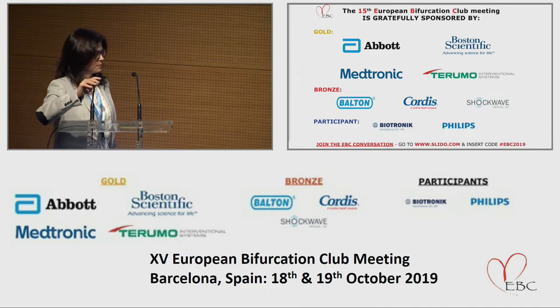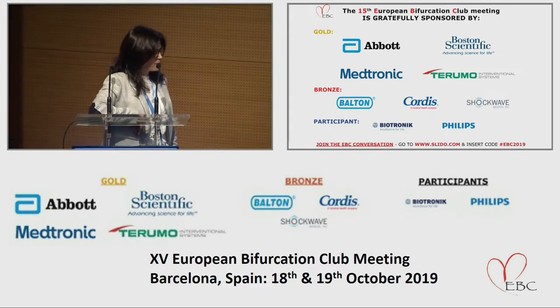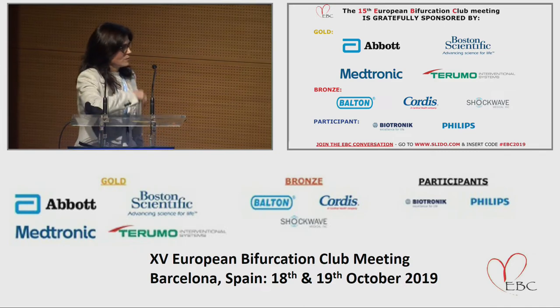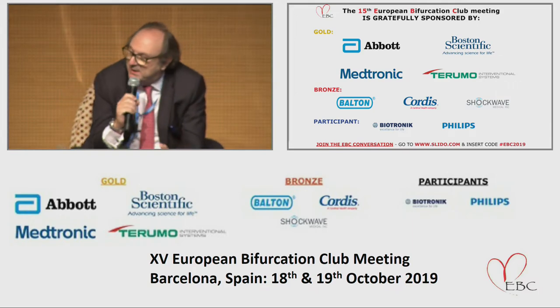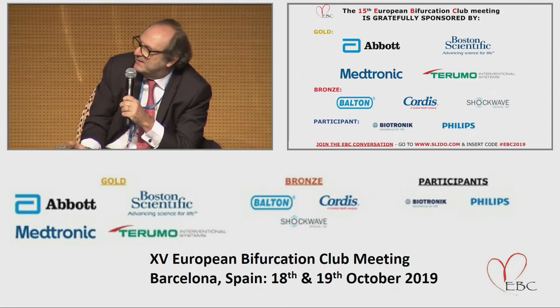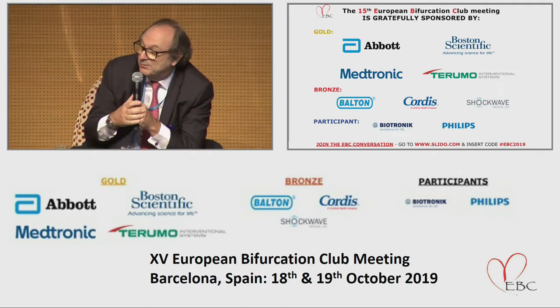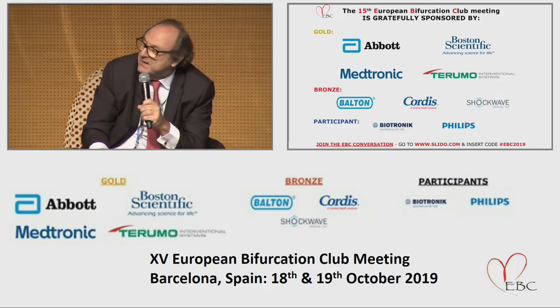Thank you, Nieves. You always show very beautiful images of calcified plaque by OCT. I'm impressed. But in clinical practice, when you try to obtain this image, in how many cases do you fail to cross the OCT catheter? Because calcified plaque sometimes is difficult to cross and to obtain a good image.